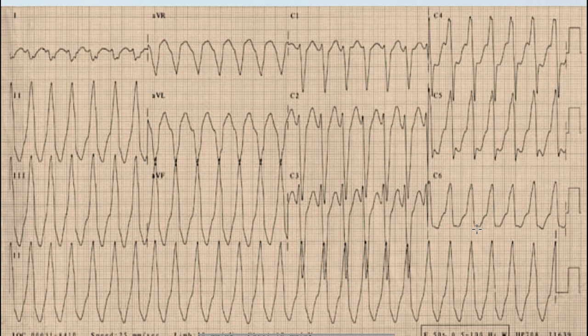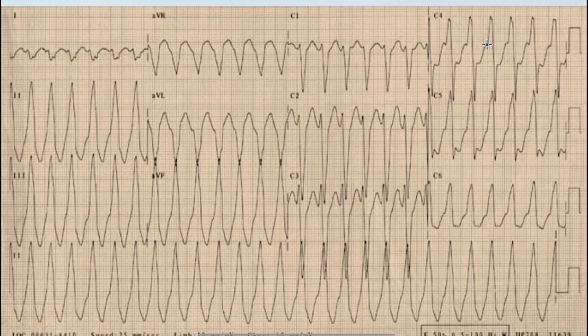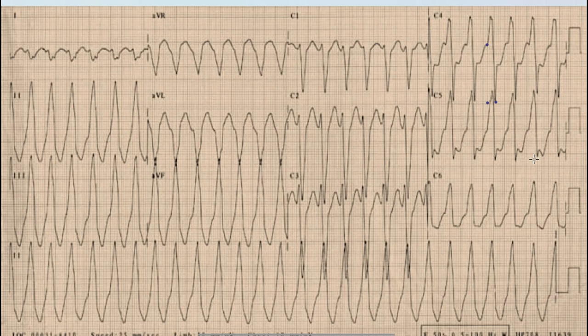Moving on to the next Brugada step: we select a QRS complex where the distance between the beginning of the R wave and the nadir of the S wave should be more than 100 milliseconds. Here is the beginning of the QRS complex and here is the nadir of the S wave. The distance is around three to four small squares, which is definitely more than 100 milliseconds.